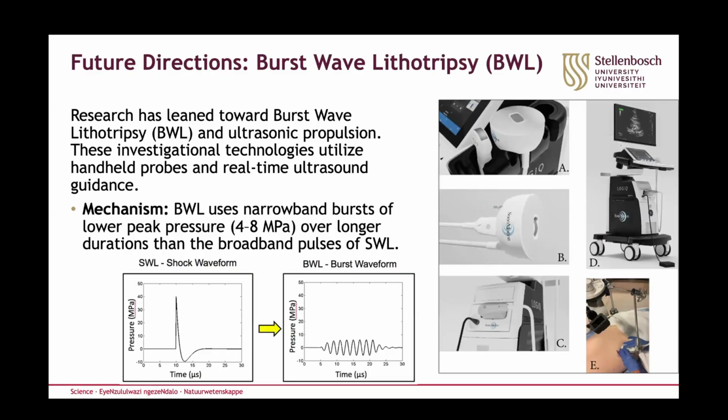Looking into the future, research has been leading towards burst wave lithotripsy and ultrasonic propulsion. These investigational techniques utilize handheld probes and real-time ultrasound.